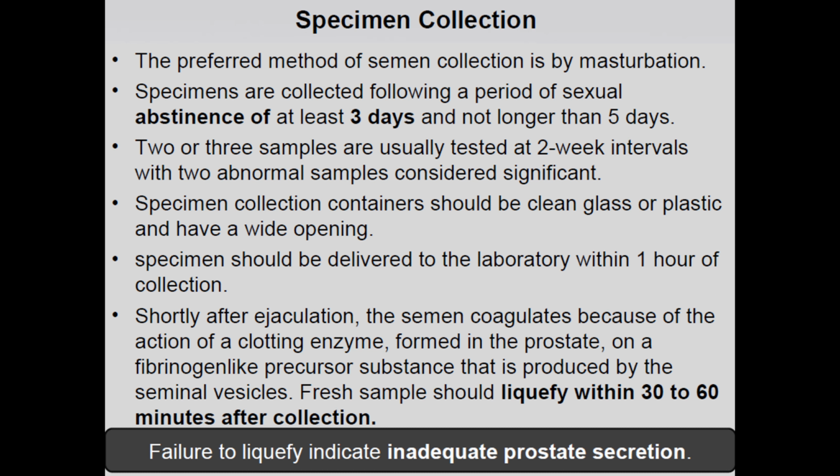Now come to the specimen collection. Specimen collection is very important. Why important? Because the most important instruction is the abstinence time. What is the abstinence time? Abstinence time is the period during which the patient is not performing any sexual activity or masturbation.